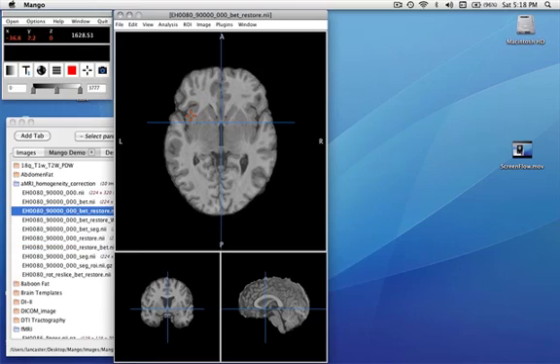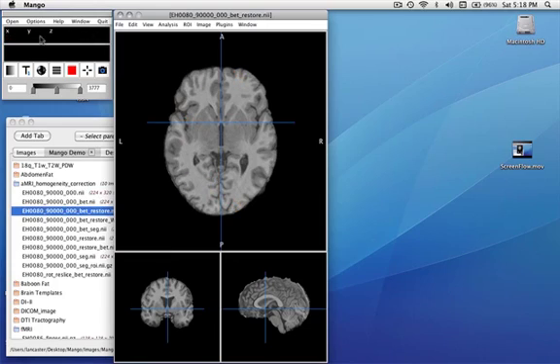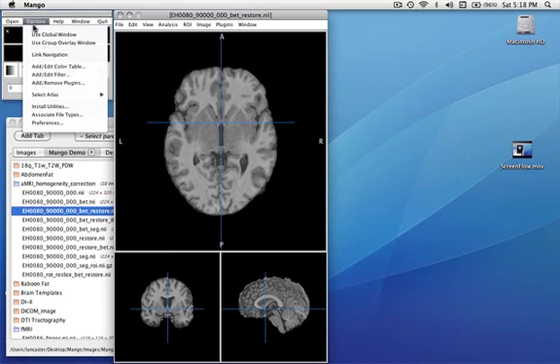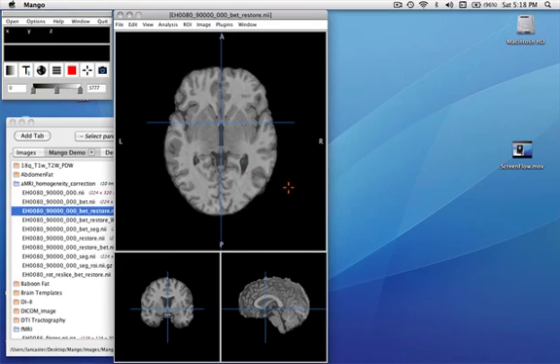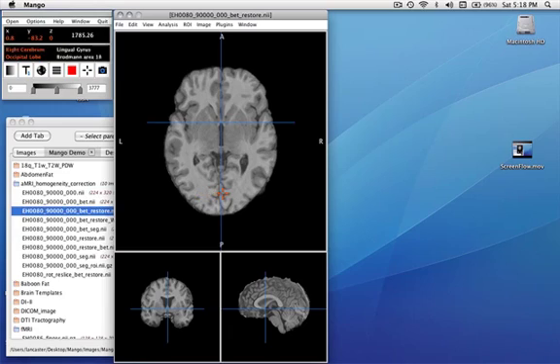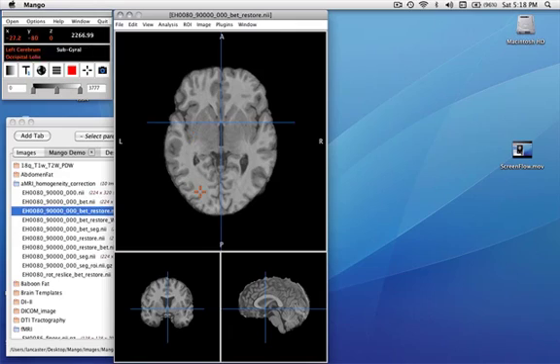Another advantage of working in this coordinate system, and in particular this has been a brain transformed to the Talairach space, is that we can select an atlas for labels. In this case, we'll use the Talairach daemon, and as I move the cursor pointer around, you can see the labels showing up in the information window.